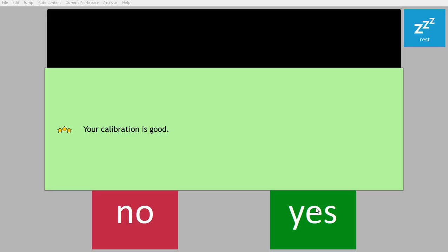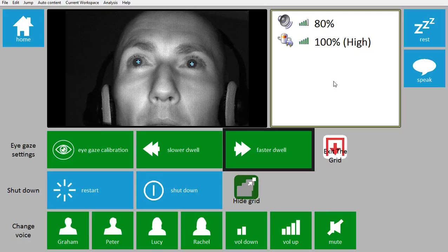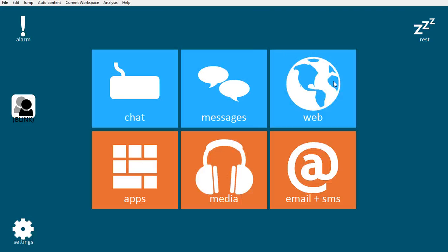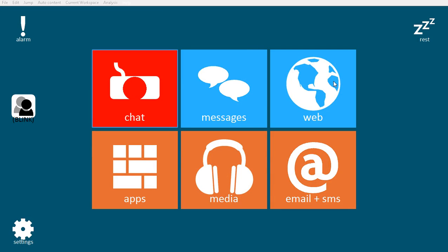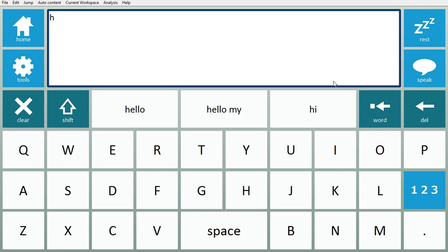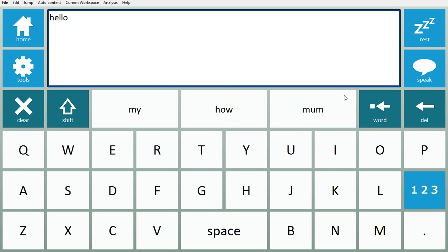It shows I had a good score and I'll select no I do not want to recalibrate, and go to home. Now I can quickly type, chat with friends and family, use the built-in word prediction.